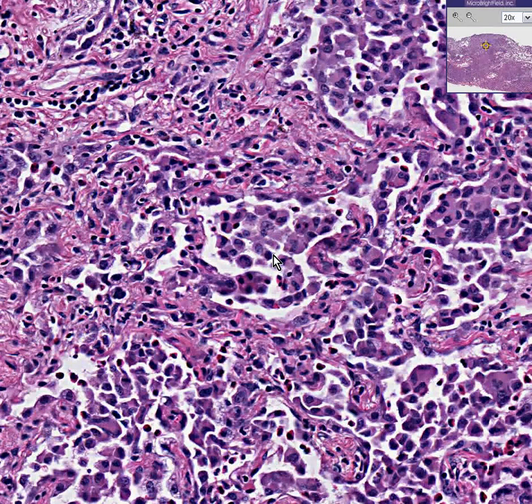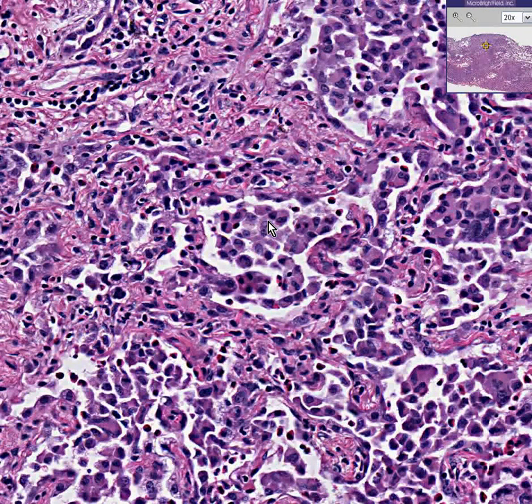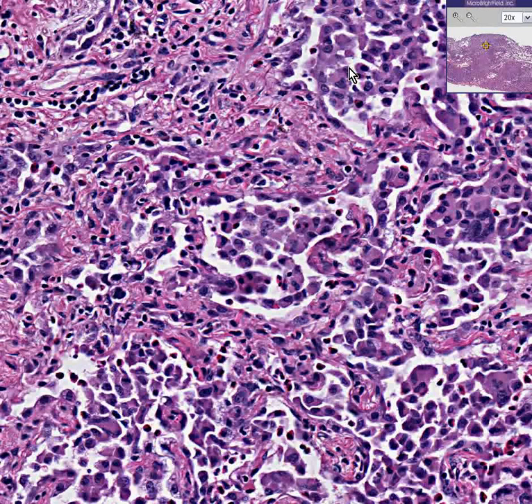These are macrophages. As you know, the normal lining of the alveolar septae consists of type 1 pneumocytes — the flat ones — type 2 pneumocytes, the granular ones that make the surfactant material, and macrophages, besides a little fibrous tissue, a couple of lymphocytes, and some blood vessel endothelial cells. It's the macrophage portion that fills up these bronchi. They kind of look like it as well — they have granular cytoplasm and maybe some particulate material, but these are not the classical inflammatory cells you see filling alveoli in alveolar pneumonias.